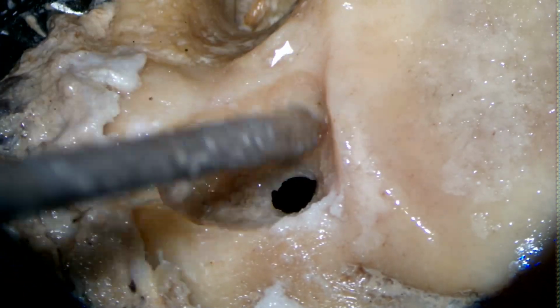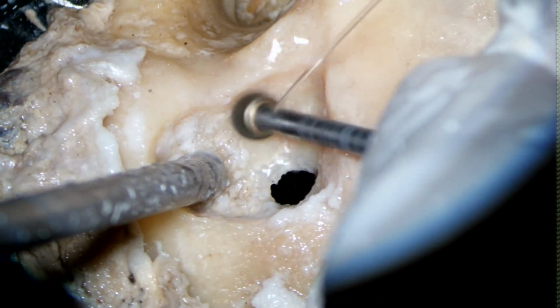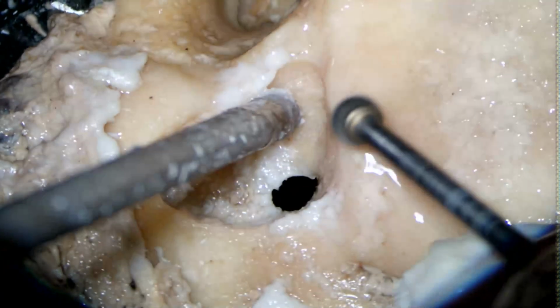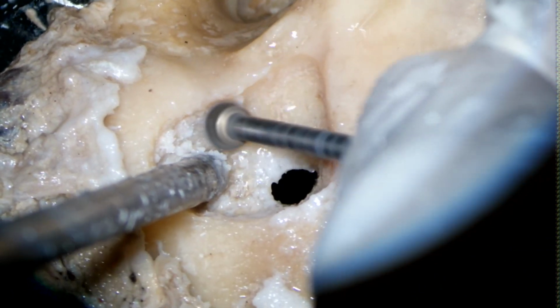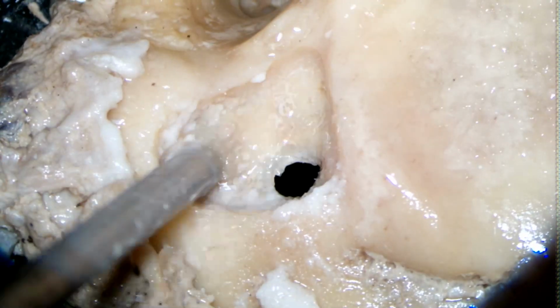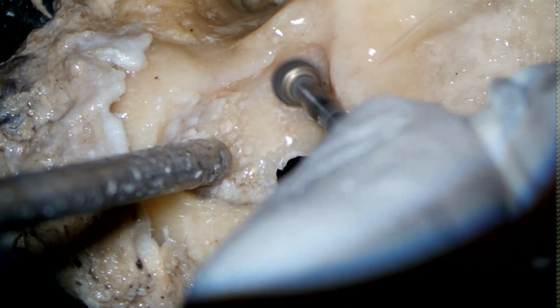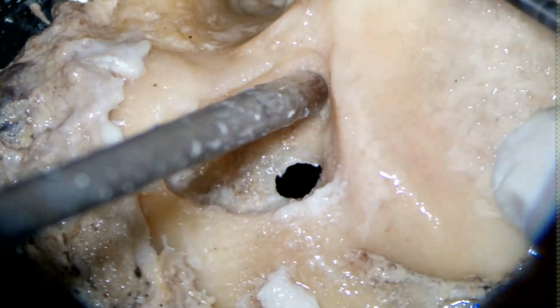Okay. So again, this is a really very contracted antrum. I have not found any mastoid air cell.